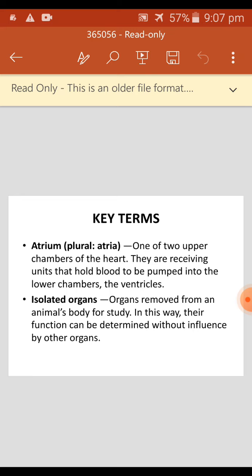Sixth one is cardioplegia control, including pressure and bubble sensor for controlling cardioplegia delivery. Time for measuring important times and intervals during perfusion, such as total perfusion time, aortic clamping time and reperfusion time.